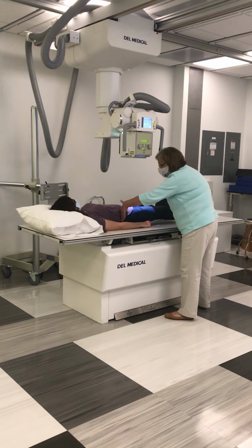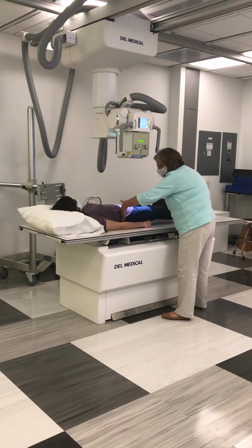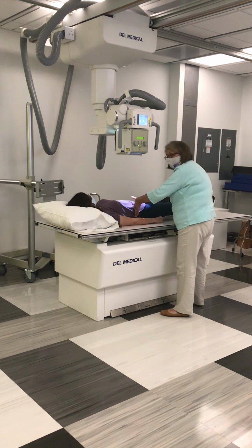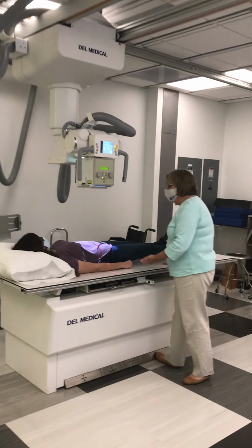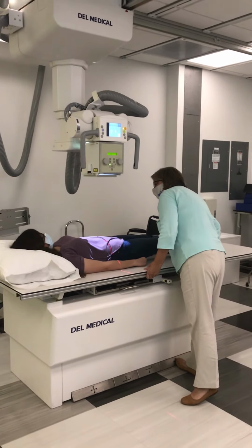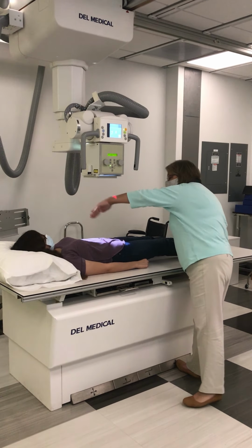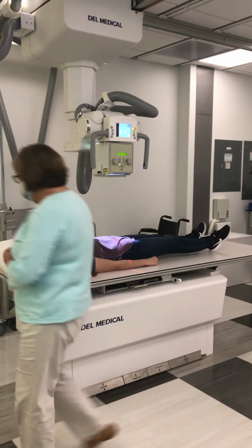Now, to achieve my centering, I don't move my tube, I don't move my Bucky, I move the table. Now I'm centered at the level of the iliac crest. I also need to center at the mid-sagittal plane in midline. So I place the central ray where I believe the mid-sagittal plane to be.